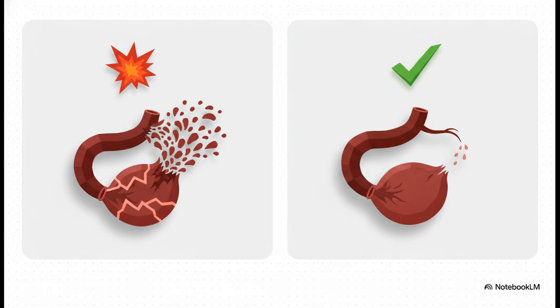But on the right, you have type 2 leaks. They come from smaller, lower-pressure arteries. They're often harmless, and you know what? Sometimes they even go away on their own. That's why type 1 leaks demand immediate action.